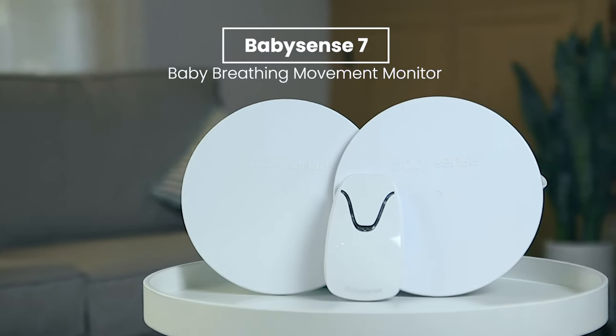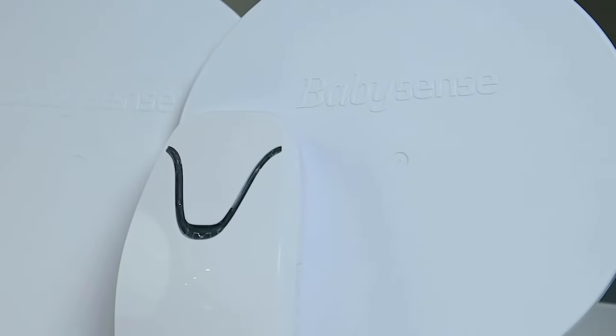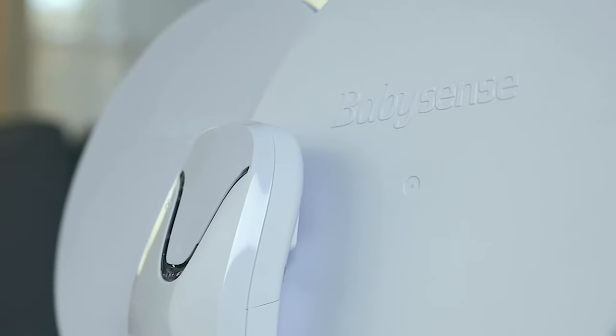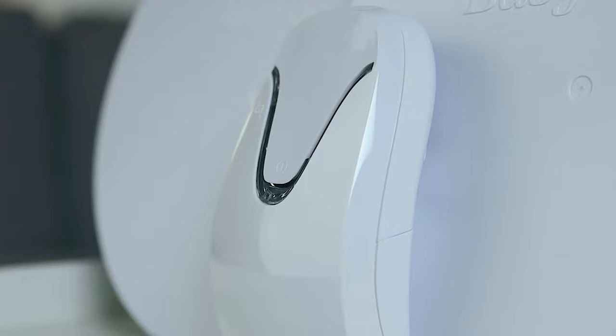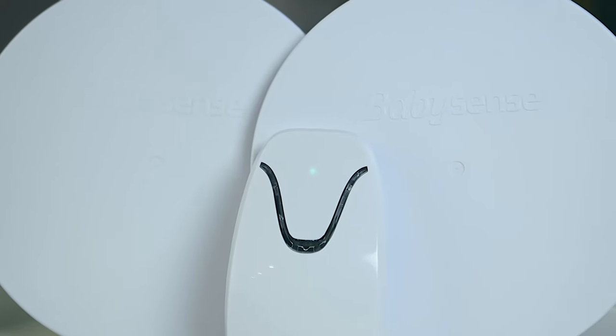Presenting BabySense 7 Baby Breathing Movement Monitor — the number one rated breathing monitor in over one million homes and hospitals. This non-contact, non-Wi-Fi breathing movement monitor is an invaluable helper in keeping your baby safe.